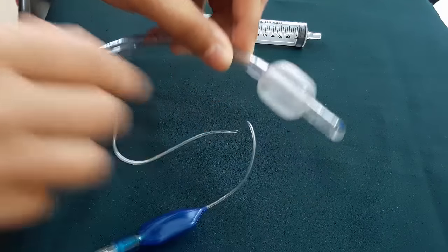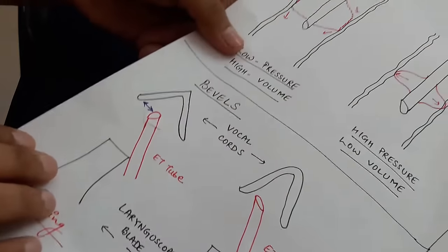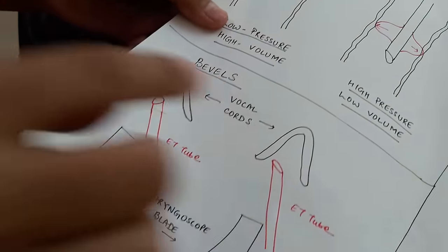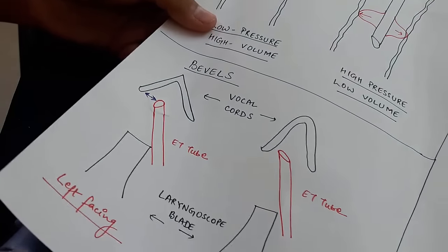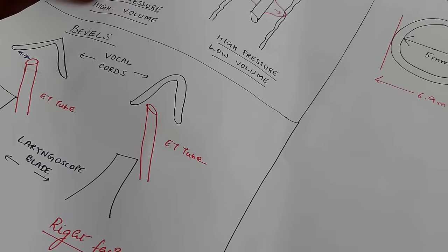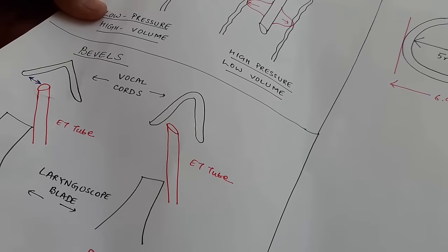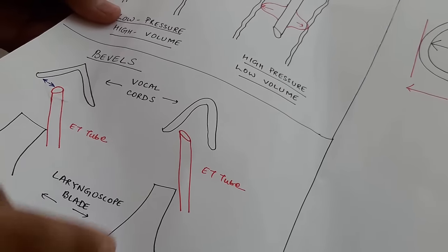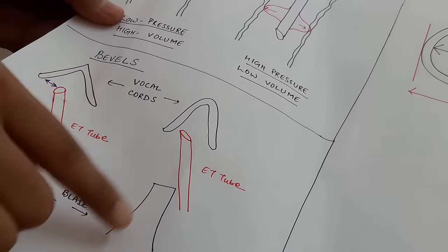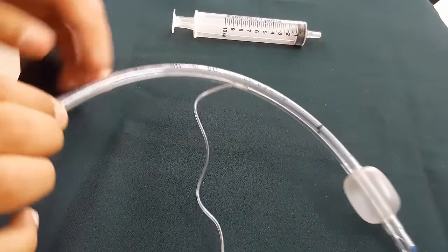Then we have the tip — a smooth atraumatic tip of the ET tube, which is beveled. Mostly we have a left-facing bevel. As you can see, there are two types of bevel: left-facing and right-facing. In a left-facing bevel, the ET tube provides a better view when visualizing through the laryngoscope blade, whereas in a right-facing bevel, the view gets obstructed when looking through the laryngoscope.